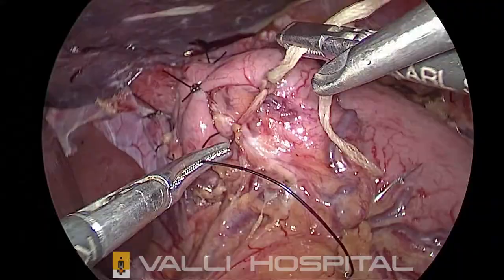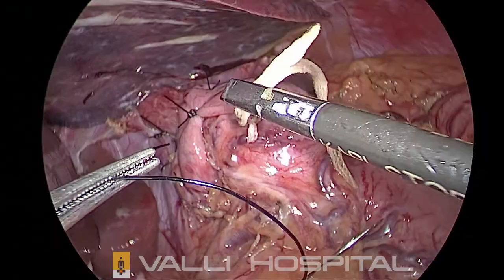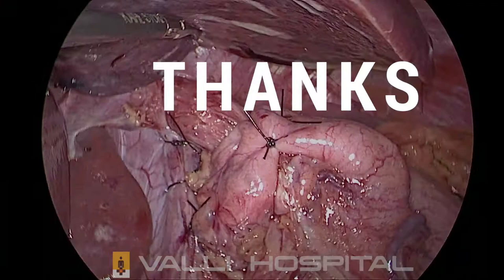Now you cut the tape. Remove it immediately. You can remove it through the 5 mm port itself. The needle also you remove through the 5 mm port.